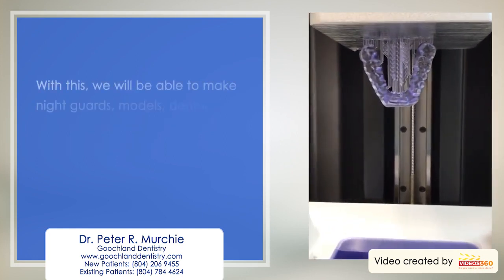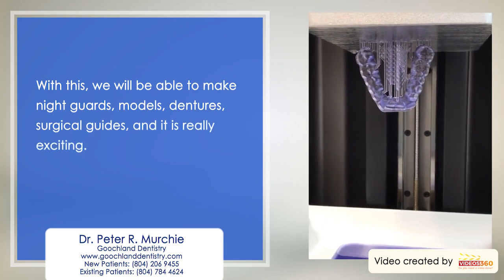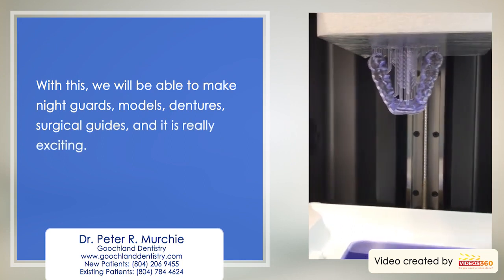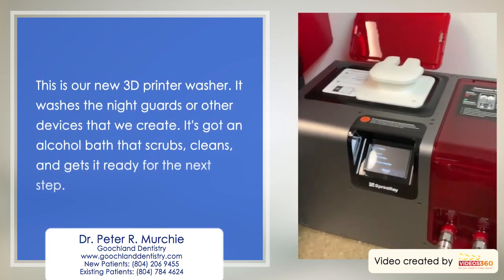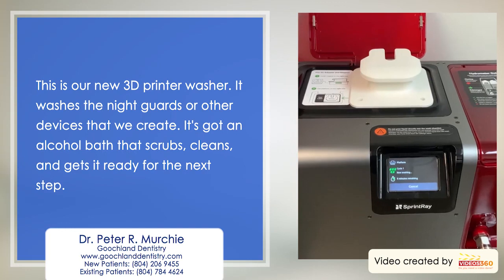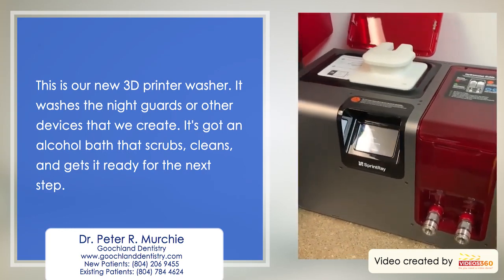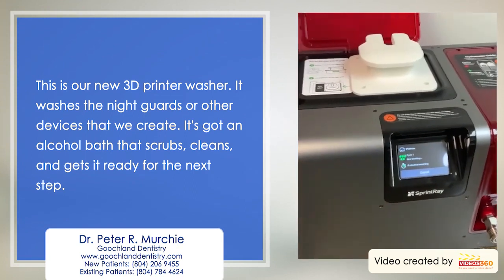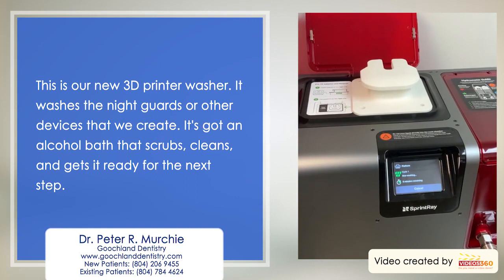Really cool stuff. We'll be able to make night guards, models, dentures, and surgical guides. Really exciting. This is our new 3D printer washer. It washes the night guards or other devices, dentures or models that we're doing, and it's got an alcohol bath and it scrubs it and cleans it up. Gets it ready for the next step.